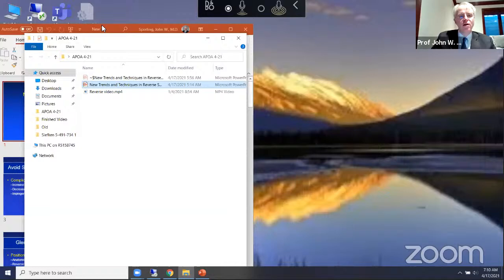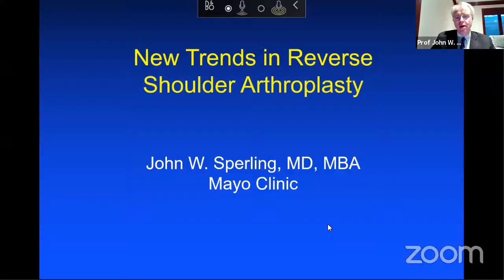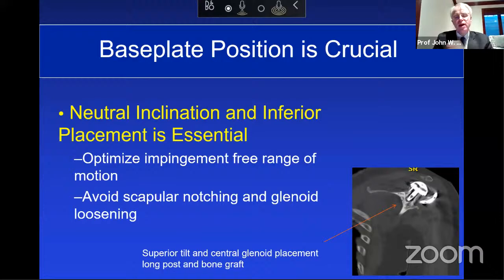Very interesting hearing about the difference of opinion, and I'll share some of those differences of opinion with you as well today. So my disclosure: we know that in reverse shoulder arthroplasty, it's essential to avoid superior tilt, to avoid component loosening as well as notching. The other aspect we've learned is that it's important not only to avoid superior tilt, but inferior placement is very important. If you place the base plate too high, you also place yourself at increased risk for component failure.